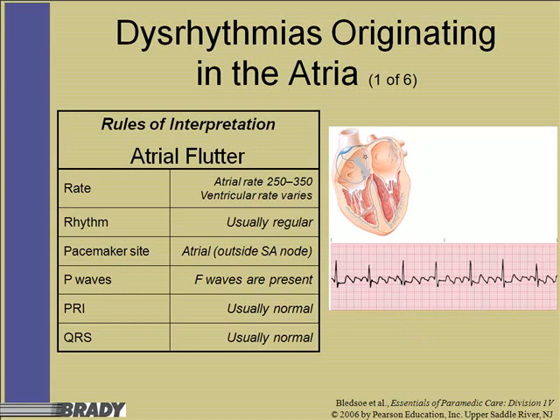These complexes are a little difficult to see, but if you measure that P wave in front of each QRS, you've got a normal amount there, and then the QRS is conducting to the ventricles. But again, at the atria, we've got a fluttering sensation that's taking place. So again, it's an inefficient thing. Doesn't push the blood around.